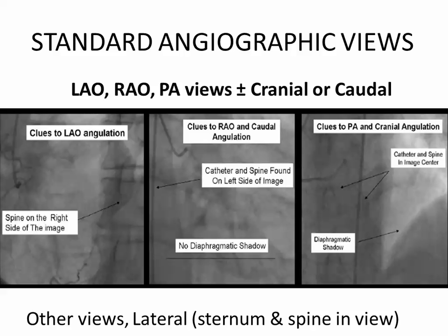What's this view? This is a spine, it's clear? Yes. So it's left. Okay? So it's LAO. Caudal or cranial? Caudal, no diaphragm. Here is the diaphragm. Okay? Here is no diaphragm. So it is caudal. Okay.